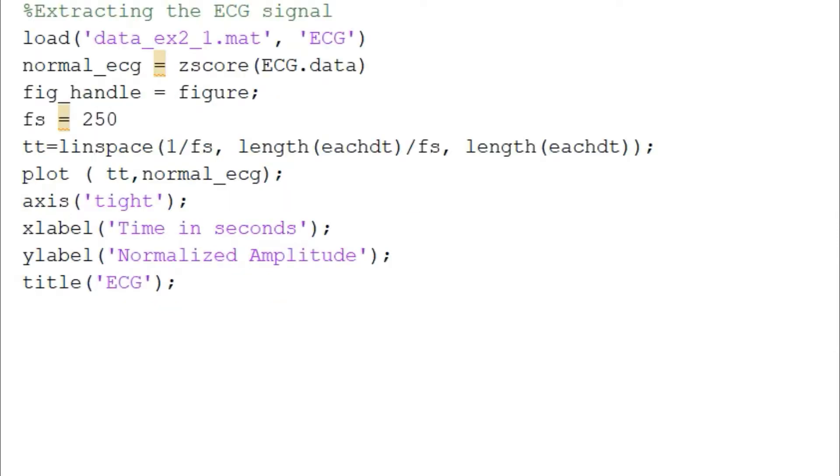We also know that the frequency of the sample is 250 hertz, and we are going to define our time scale through this simple code.